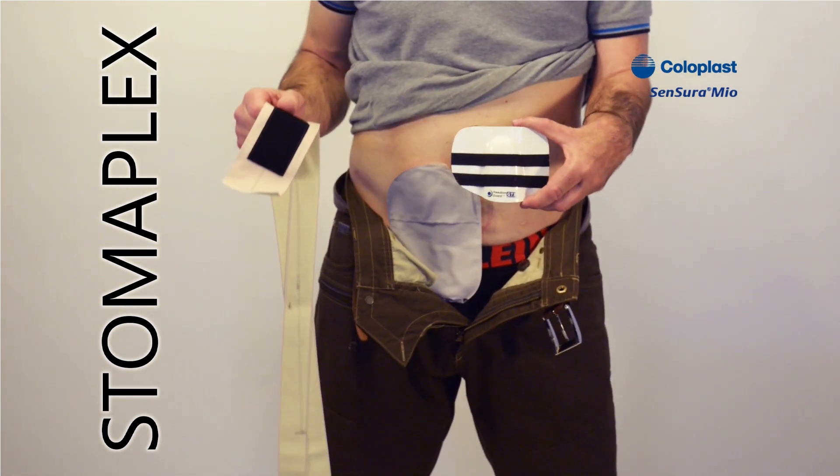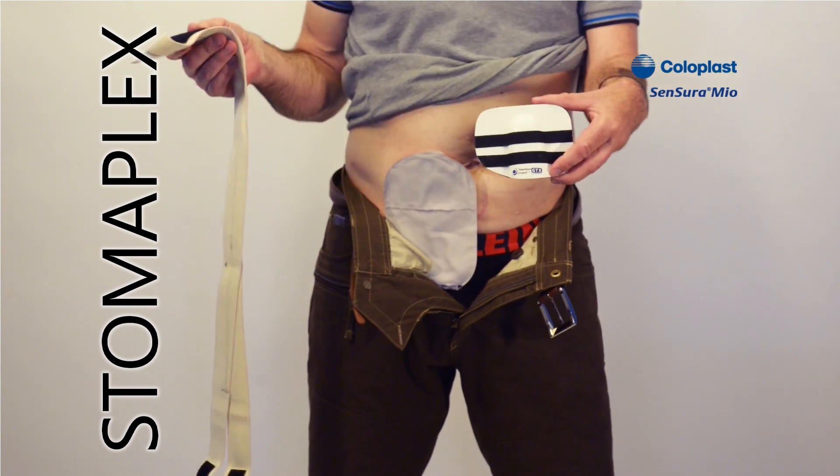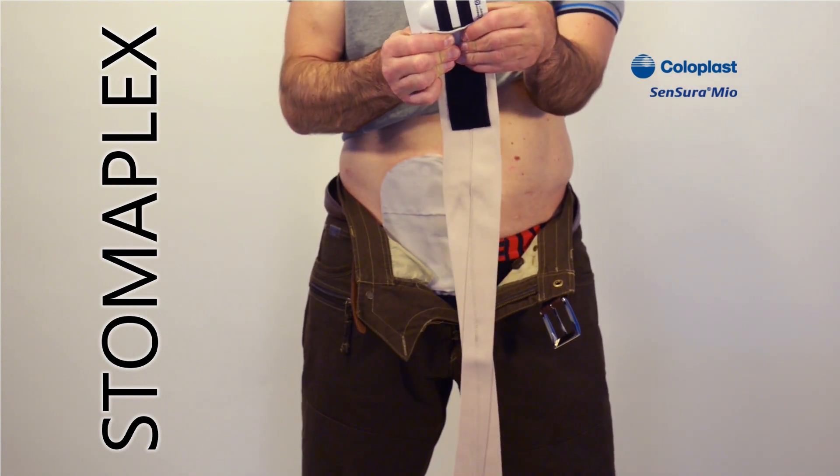Now I'm going to show you how easy it is to put on the Freedom Guard GTX. Here's the guard and the belt. The belt attaches by rubbing it onto the face of the guard, like this.